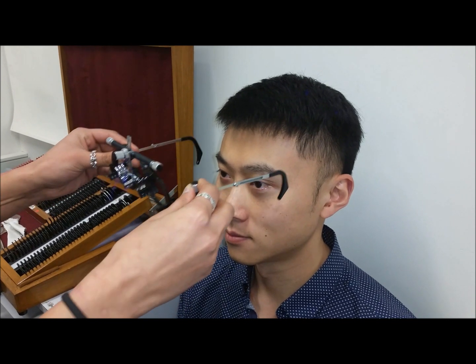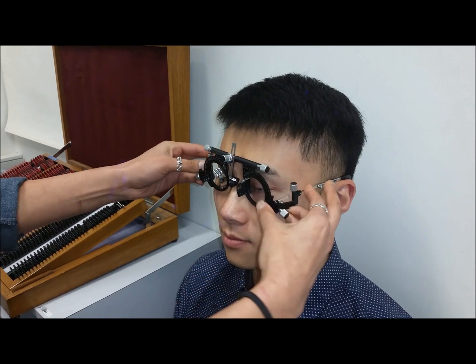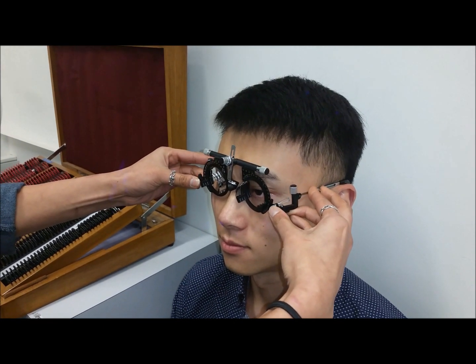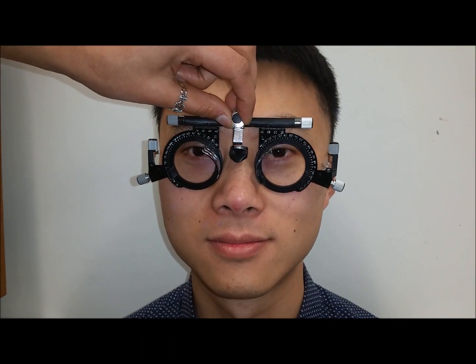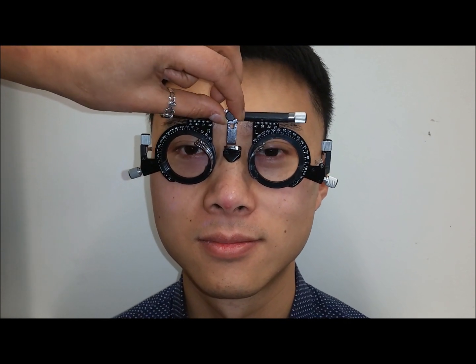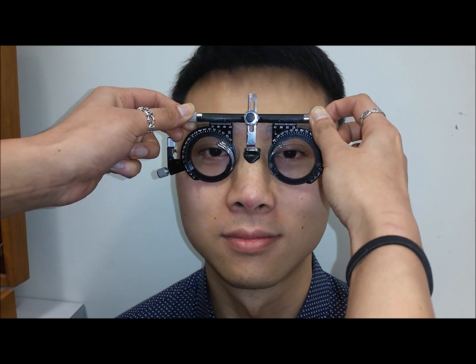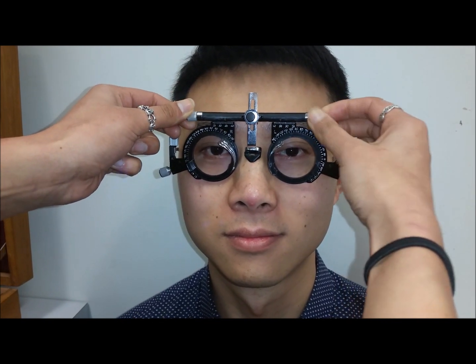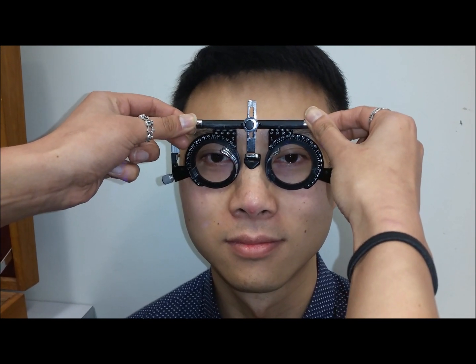Setting up the patient. Initially, the orthoptist will fit the trial frames onto the patient by tightening the arms, adjusting the nose piece, and adjusting the IPD so that it sits comfortably on the patient. Conventionally, the right eye is tested first, so the orthoptist will place the occluder in front of the left eye.